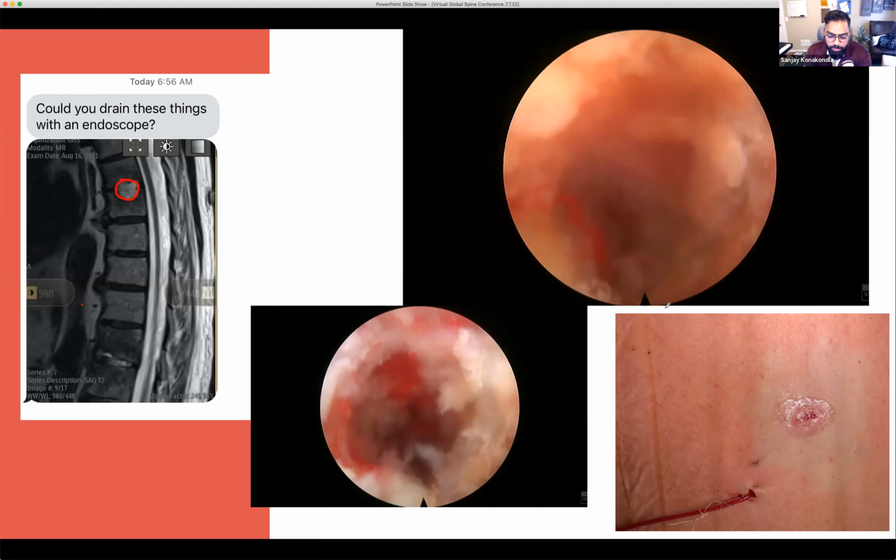It's not fun to apply it just to apply it, right? I think there has to be some reason to try these approaches. In this case, if we tried to approach this surgically, it'll be a much larger incision for bony resection, and it's asking a lot for a patient to heal when they're trying to cure an infection.